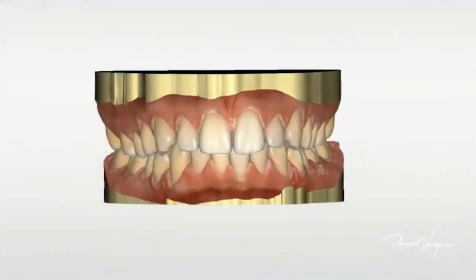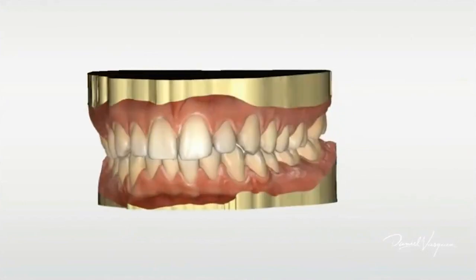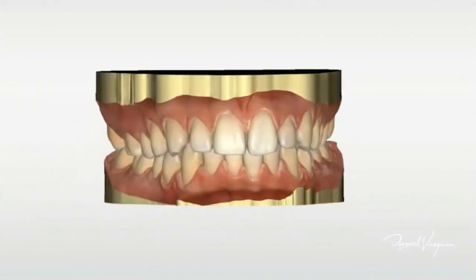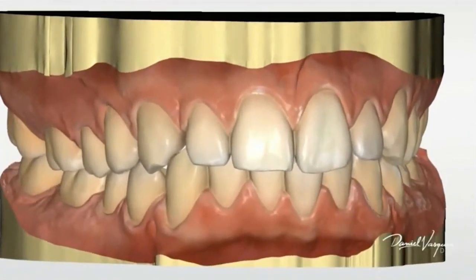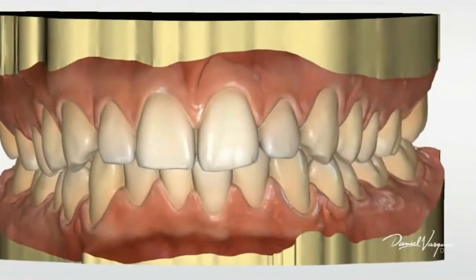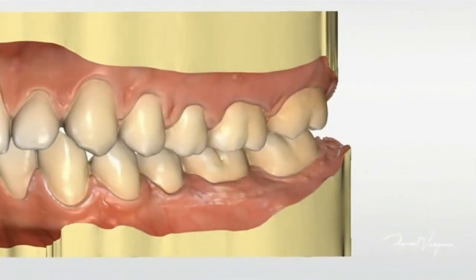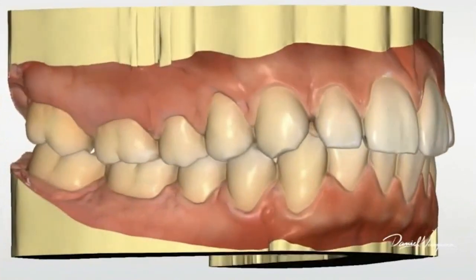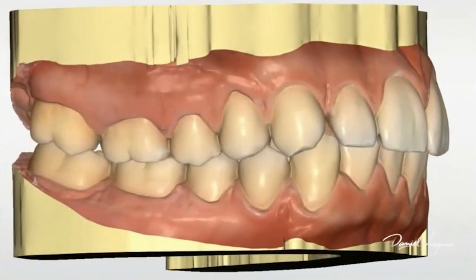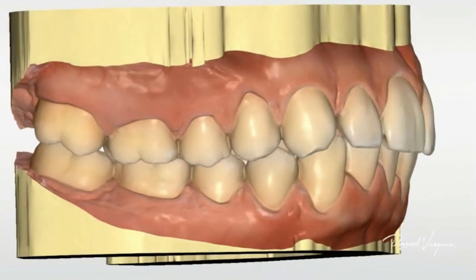The quality that we have today, these impressions, it's just incredible. Before, it was necessary to have good impressions of teeth. Today is about the entire impressioning of the soft tissue, the teeth, being able to see embrasures, the anatomy of the teeth, the palate, soft tissue. It is very important.